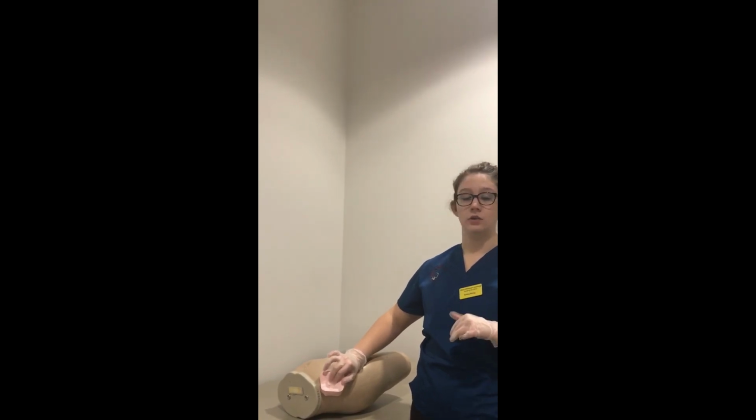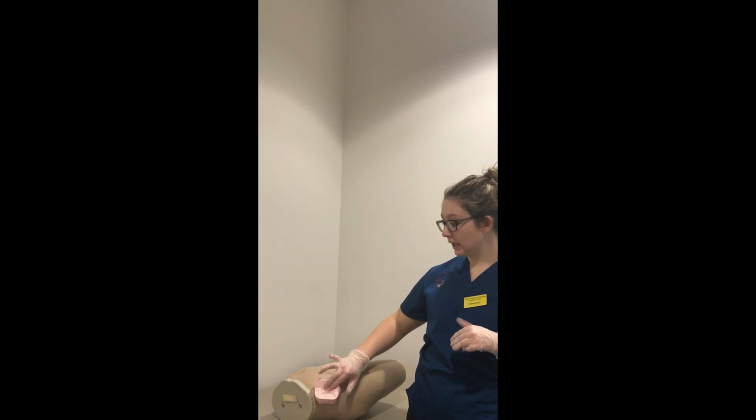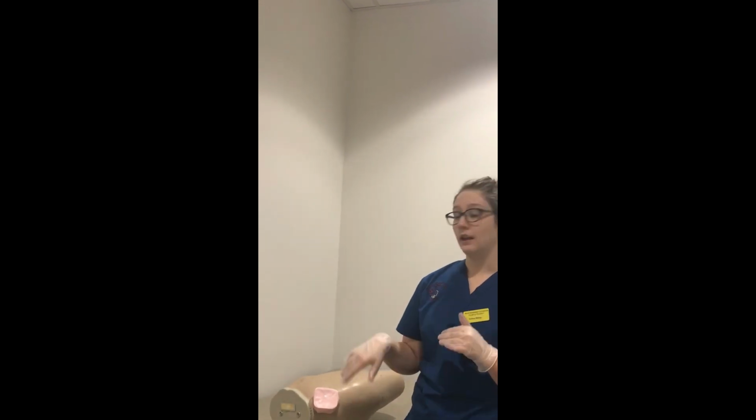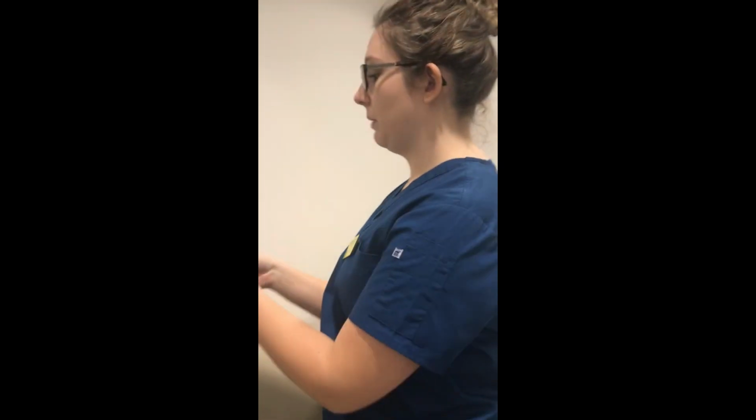Before I gave the injection, when I drew back, if there was blood present, then I would start all over with new equipment and new medication, and then go forward with giving the injection. So there is no bleeding, so then the patient is okay, and then I will return to check up on the patient within 15 to 30 minutes to make sure that the medication is working. Now I will take off my gloves. I will throw all my equipment into the disposable, and then I will dispose of the needle in the sharps container.